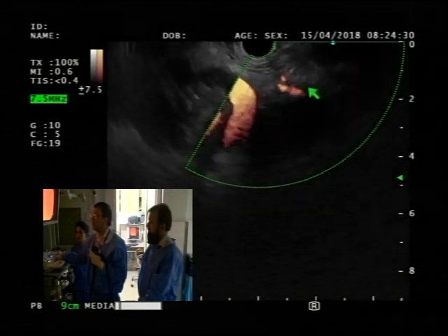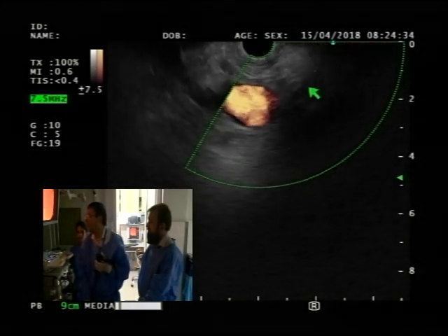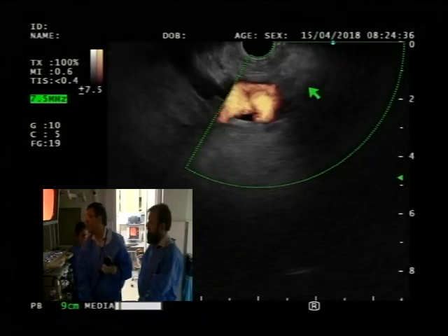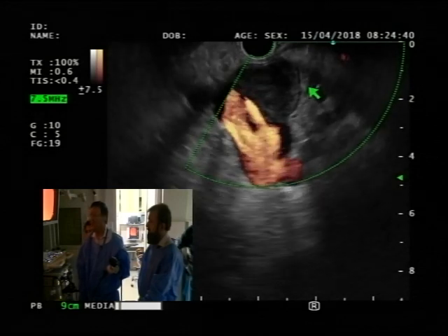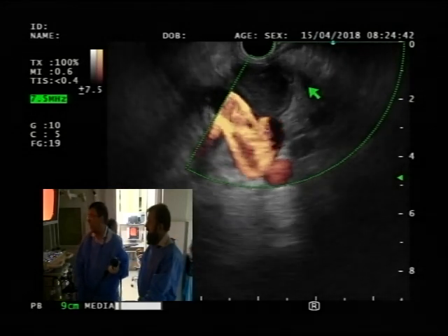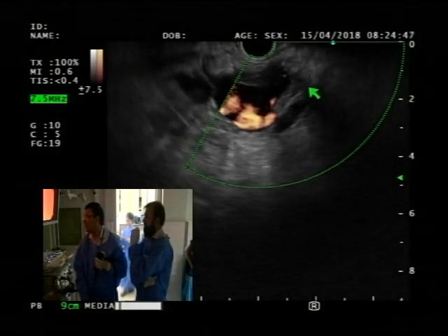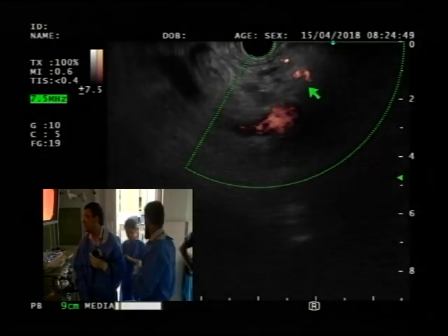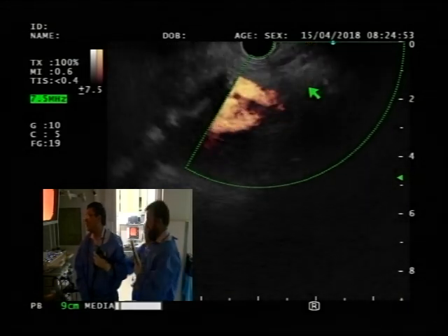Amjad has just made a point, and that is, although I haven't seen the CT films, the CT is saying the mass is in the body, or is it the neck, or what? I think they are telling me it's in the body. The distal body. Yes. Well, I have seen worse reports, so I'm not going to make any comment.